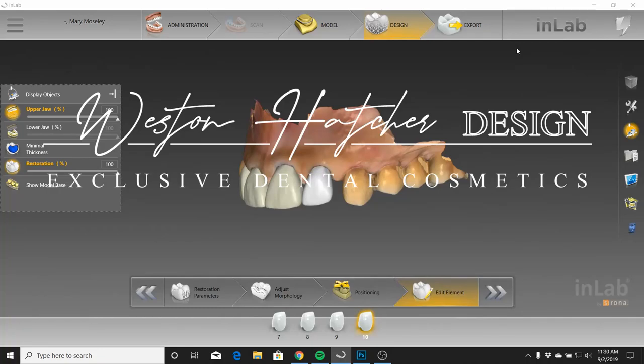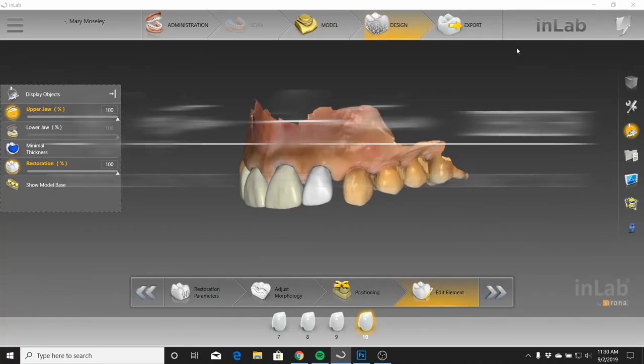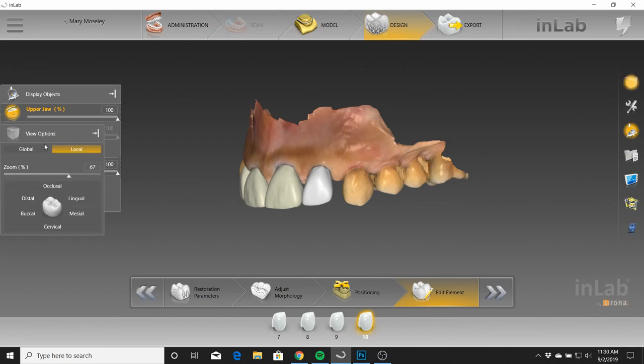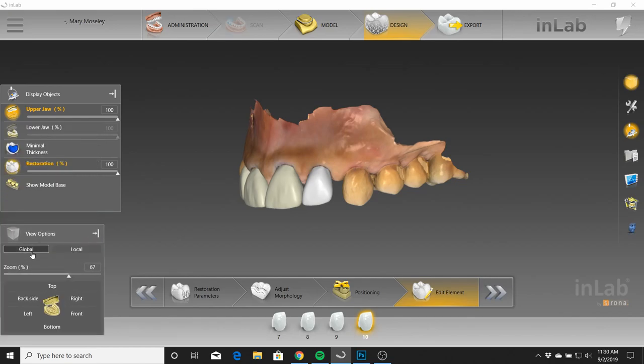Hey everyone. I'm just making this video to go over some designs with you of daily work — just the kind of nitty-gritty stuff that I'm doing on a daily basis. This isn't the picturesque, beautiful 8-unit anterior design where everything went perfect. This is just daily work. I'm going to run through a couple of these cases with you guys just to give you an idea of what I'm doing, and maybe you guys can learn something from this based off of how I handle some of these designs.